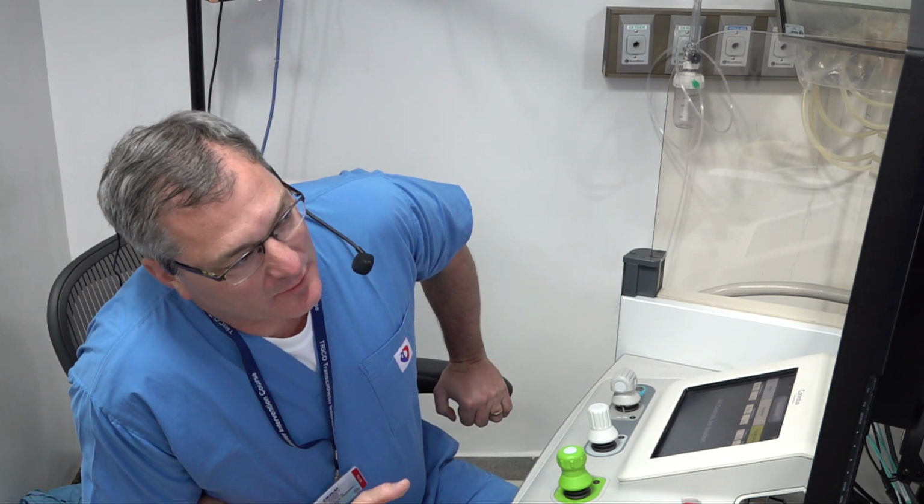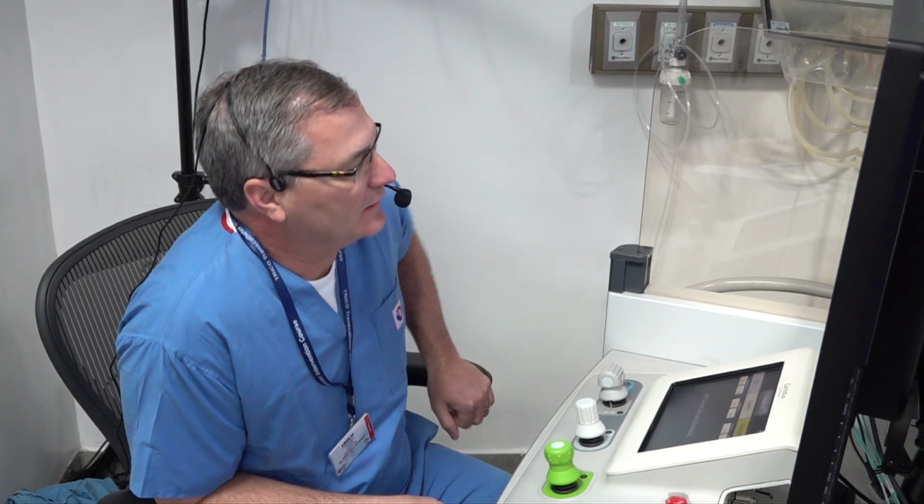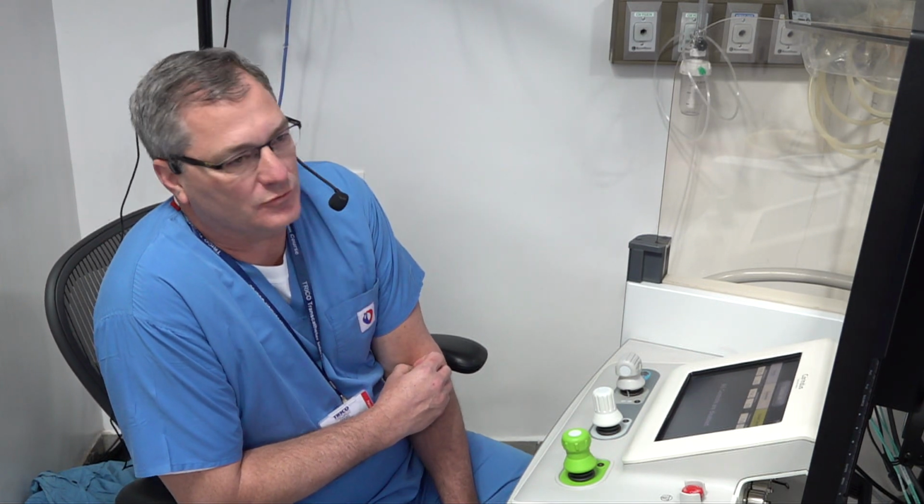Great. Well, welcome to the other lab. We've been awaiting your arrival. I think you can see on the screen the LAD lesion that we're going to approach today. We've had a lot of discussions about how to approach this. Initially, the thought was roto-stenting. I think we're going to take away from the lessons this morning and do some imaging before we decide on whether or not to rotablate.